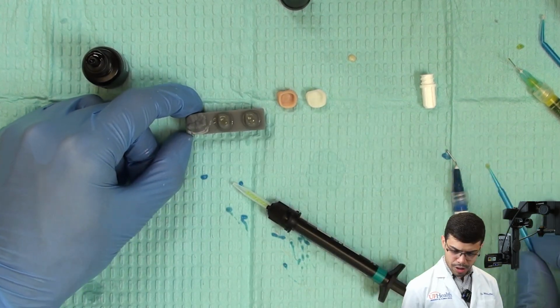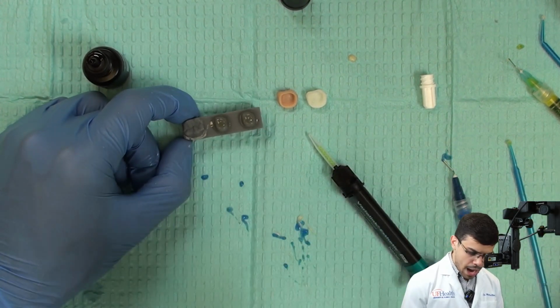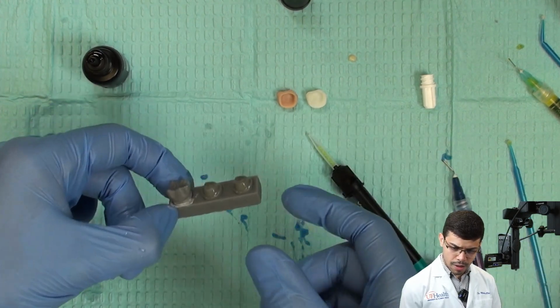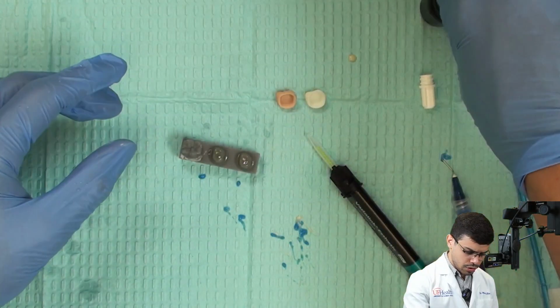All right, after I scrub my adhesive system here, I need to air thin a little bit. I'm not going to light cure because I will light cure everything together in the end, okay? There are these two ways to do.